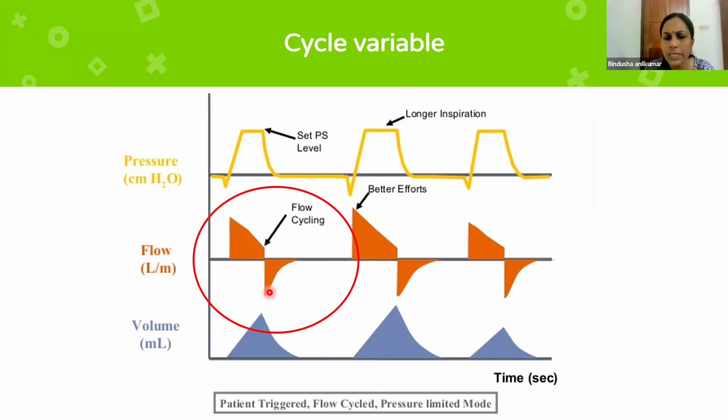I hope you understood that. So what you need to know is that all the supported breaths are cycled by the flow cycle. All the control breaths or assist breaths, for our purpose, we will always consider that they are cycled by time cycling. Once the set inspiratory time is over, they will cycle to the exhalation.